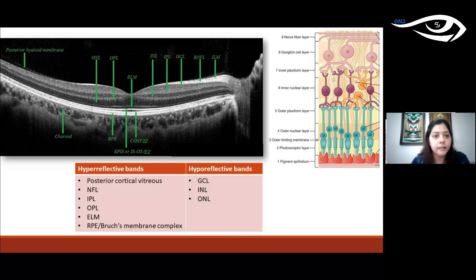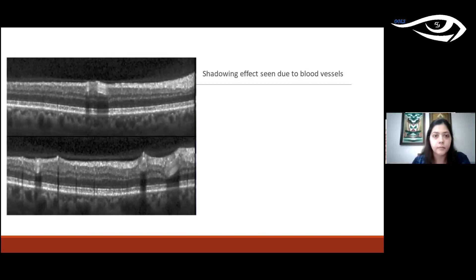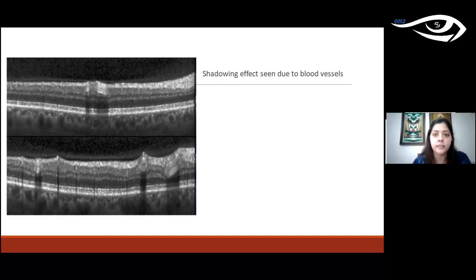The junction between the vitreous and retina is called the vitreoretinal interface, and the junction below at the choroid is the chorioscleral junction. A normal shadowing effect can be seen on OCTs due to blood vessels running through the retina — wherever there is a blood vessel, you will see a hyper-reflective area with some shadowing behind it. This is a normal finding.